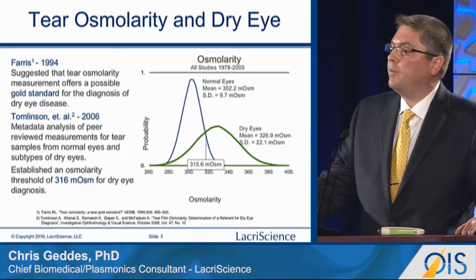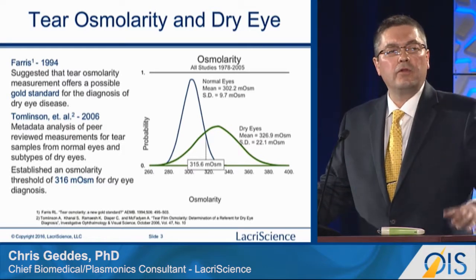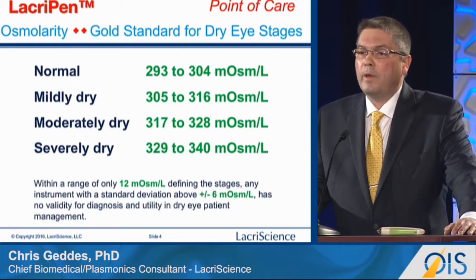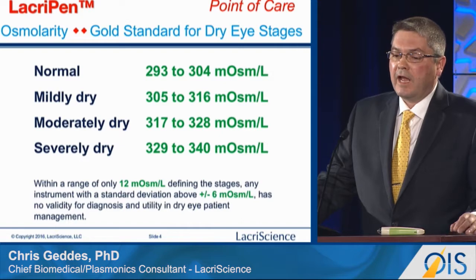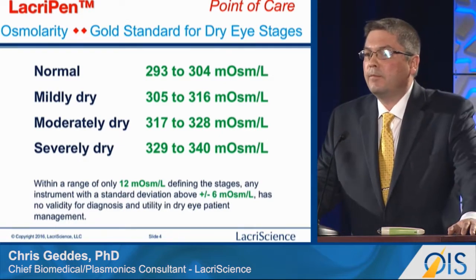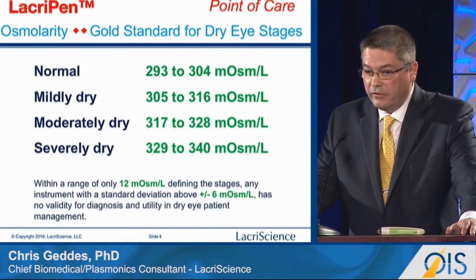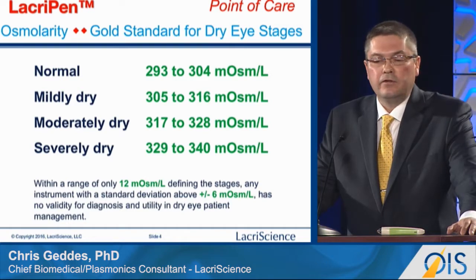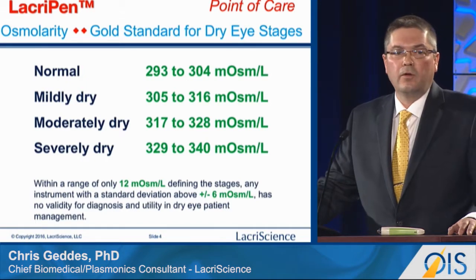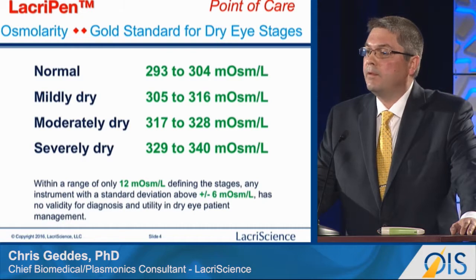We all know that for a normal, healthy patient, the osmolarity of the eye is around 300 milliosmoles, and it can increase to as much as, say, 360 milliosmoles for very severe dry eye. What we perhaps don't all realize is that we need a device today that has a sensitivity of about 6 milliosmoles to accurately and reproducibly diagnose the different stages of dry eye, from normal to mildly to moderately and severely dry eye. Unfortunately, there is no device in the world on the market today that has a sensitivity of 6 milliosmoles or better to be able to do that.